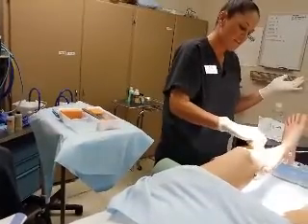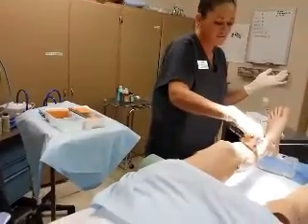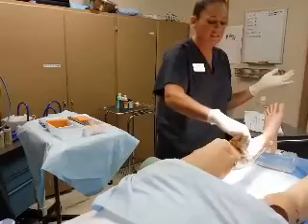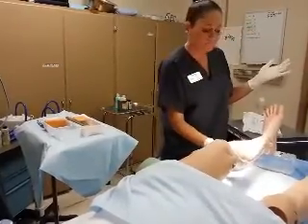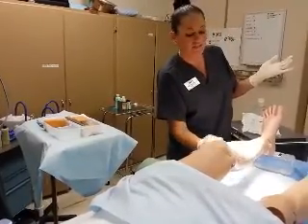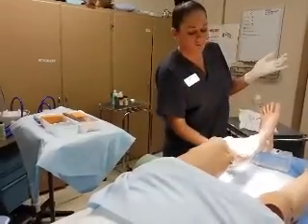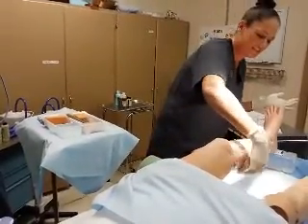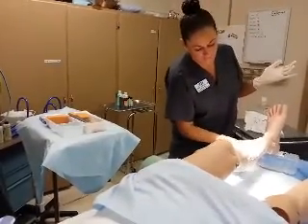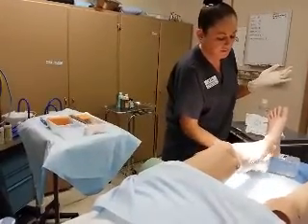Really scrub that incision site good. That's your biggest scrub. And do your little circles all the way around again. Miss Eason, are you having them do all 6 or just 5? 5. Okay. Different manufacturers package sponges in different counts. The most common way and the old way is 5. Some of them are doing 6. See how we've gone all the way around?